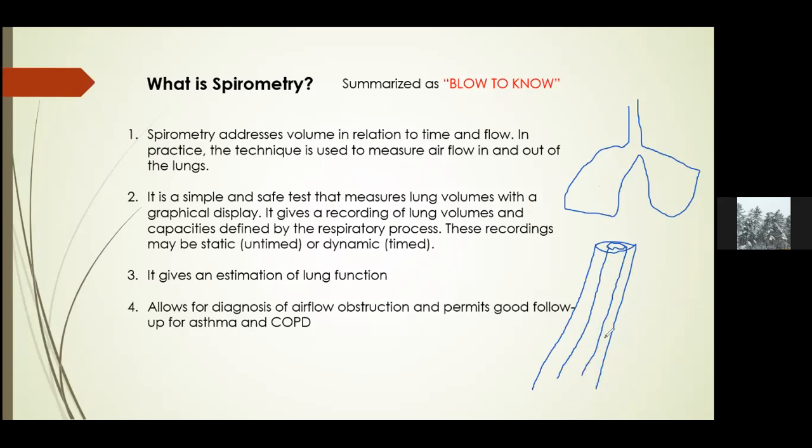You can compare a healthy individual who is able to breathe in without any resistance and one who is unable to breathe in by looking at the volume of air. For that reason, you can use spirometry to determine the lung function of that particular individual.